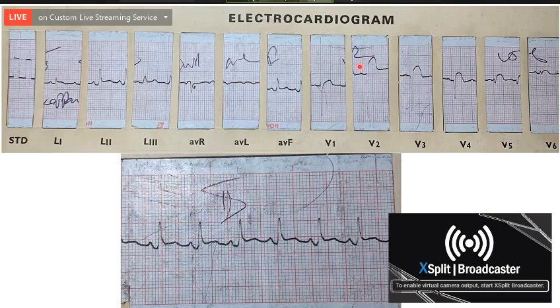And what happens? ST elevations in V1 to V6, sir, with poor R progression. Yes, not poor. There are Q waves. Why did you say poor R progression? Actually V2 is very rudimentary, almost Q waves. And in V3 and V4 there are Q waves. So for practical purposes, V2 also can be taken as a QS pattern. What else happens here?